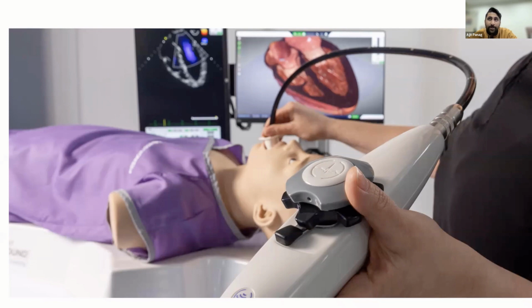And so in my opinion, the low fidelity simulators and the high fidelity simulators are best used in those more rare applications. Something like echo or lung ultrasound, you can just show up in the ED and do as many lung ultrasounds or as many echoes as you want. And in fact, I think it gives you better training doing it that way, because you get the difference in anatomy and the variance, and some training in practicing with limited body habitus and other anatomical variants as well. So something like TEE is where I think simulators really shine.